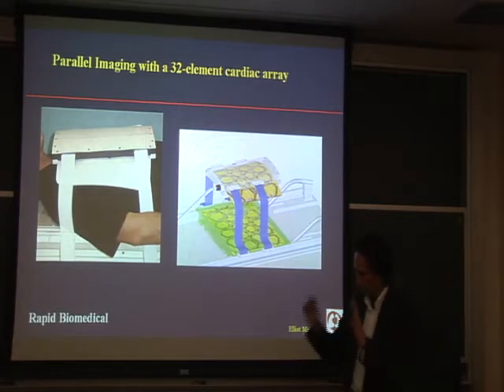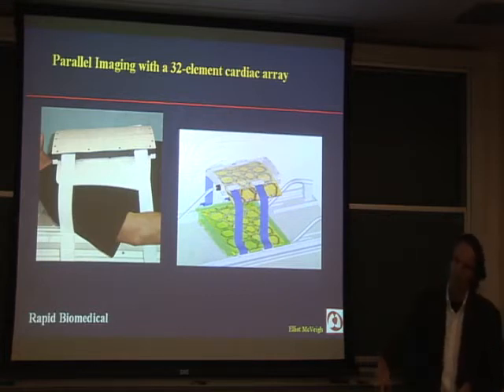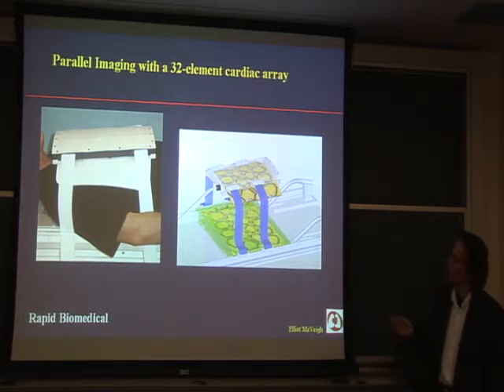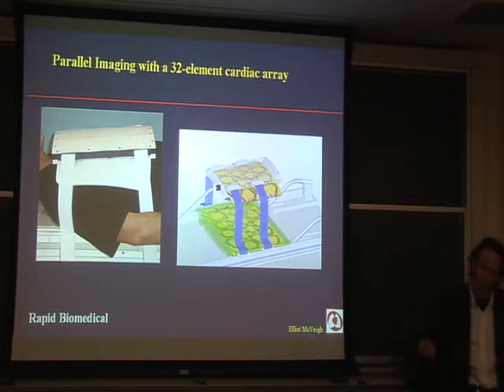So, there's the motivation for using MR in cardiac research. What we'd like to do is speed up the acquisition so that MR is something like an ultrasound, so that you can just take 30 frames a second and look at the heart while you're doing something. In order to do that, one development that's occurred in magnetic resonance is using a large coil array around the patient to reduce the amount of data that is required to make a full picture. Let me describe this coil array that Pete Kellman in my lab and Rapid Biomedical worked out, designed for the heart as a good geometry to do this type of accelerated imaging. I'll show you how this works.